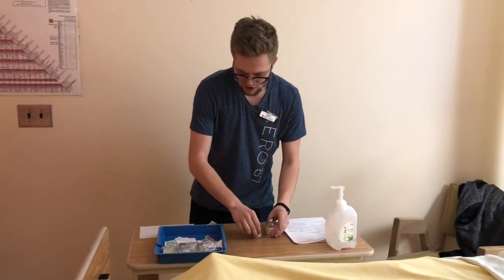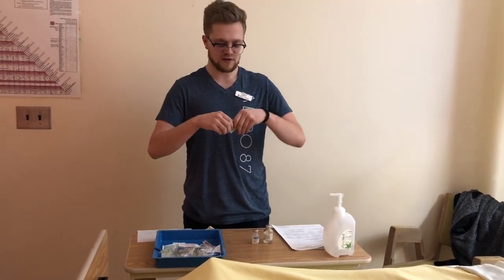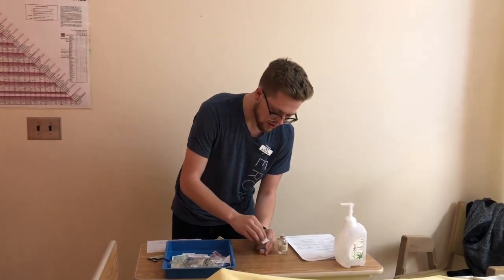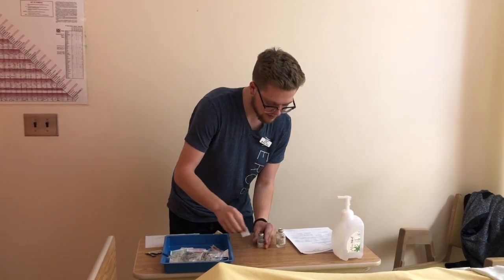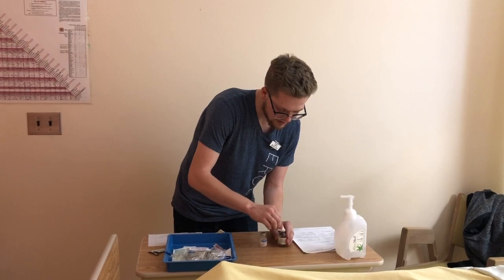So we have these 2 here, and we're going to get started with the medication preparation. I'm going to be swabbing these. For the sake of the video, I'll just be doing it a little quicker, but normally we would be doing 30 seconds wiping and then 30 seconds drying. We're going to let them dry for 30 seconds each.